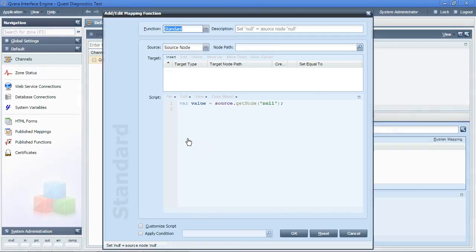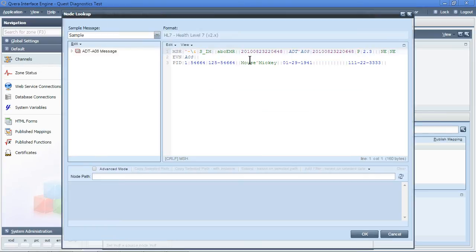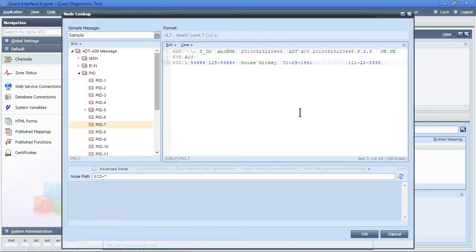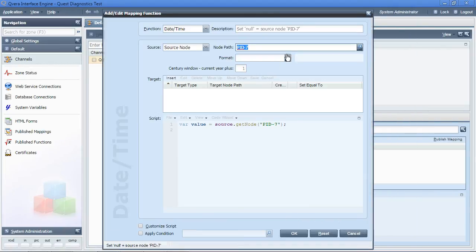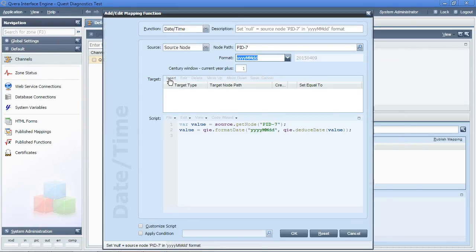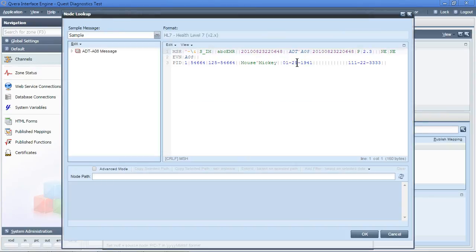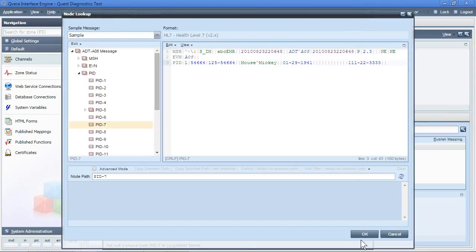The next mapping will be to do a date and time formatting. We will take the patient's date and time from the input message, reformat it into the year-year-year-month-month-day-day format, and put it back into the outbound message in the same field.